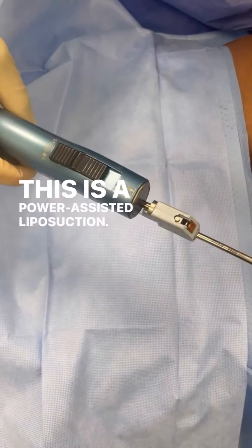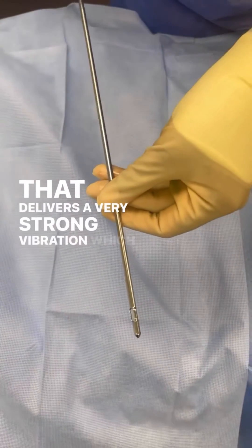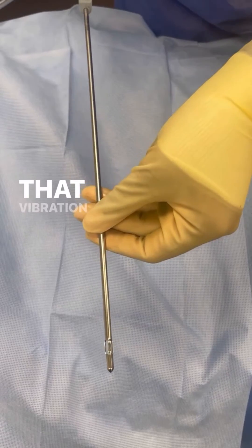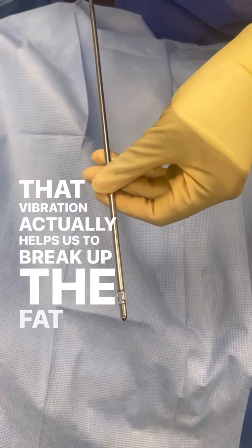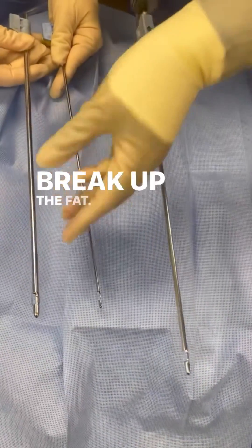This is a power-assisted liposuction. You can see the handpiece there. That delivers a very strong vibration, which I'm going to show you in a second. That vibration actually helps us to break up the fat. And what happens is a repeated in-and-out motion to constantly break up the fat.